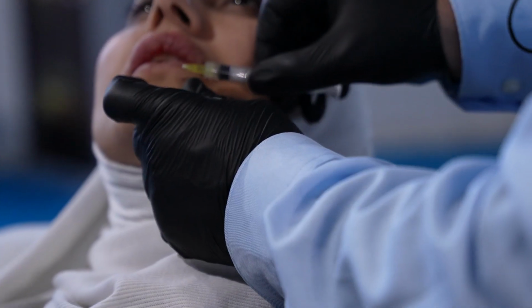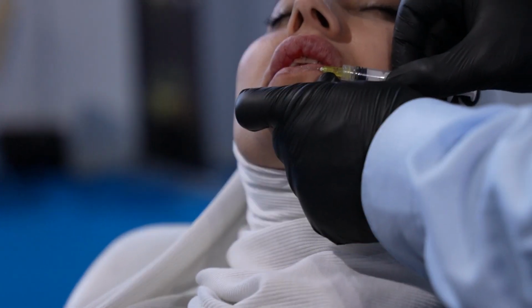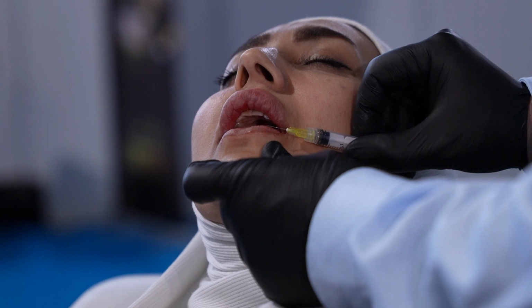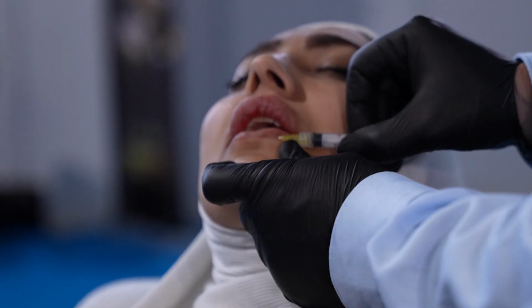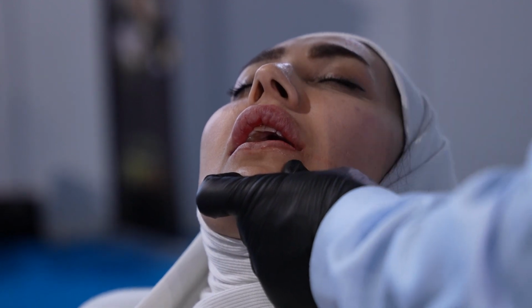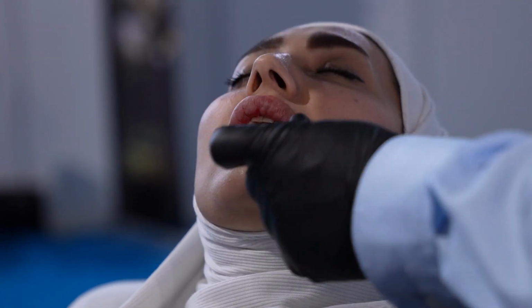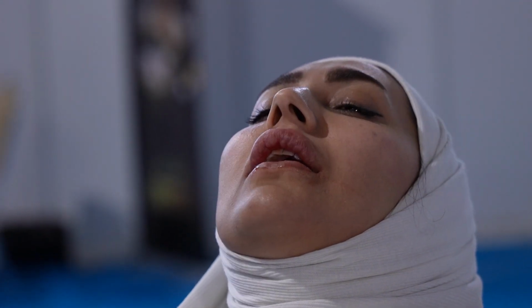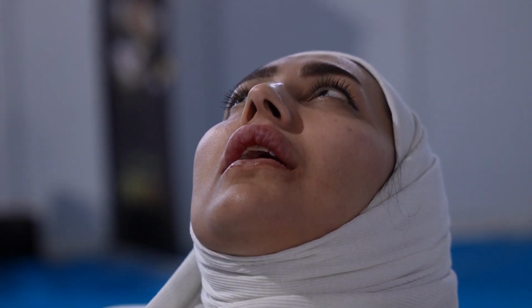No, we will divide the contour of the lower lip into two halves on each side, and just inject to the middle one, from the right and the left. So 0.3 here will be 0.6, and the upper will be.